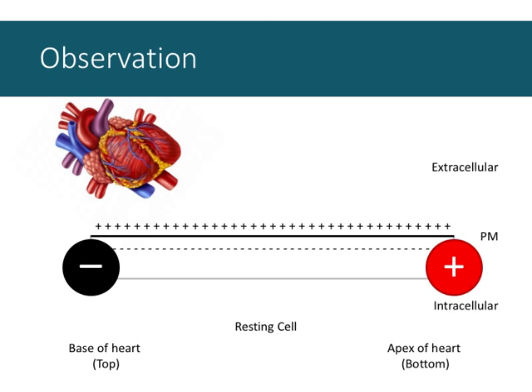I'm only doing this because I want to catch most of the activity. Wherever I set up the electrodes dictates the vector of observation. And that's going to be important as we transition to understanding the 12-lead ECG. But here, I'm letting the main vector dictate where the electrodes go. So the electrode on the right-hand side, the positive electrode, goes near the point of the heart. The negative electrode goes near the root of the heart by the vena cava and the aorta. And we observe in kind. This is what would be set up for a lead 2 ECG.